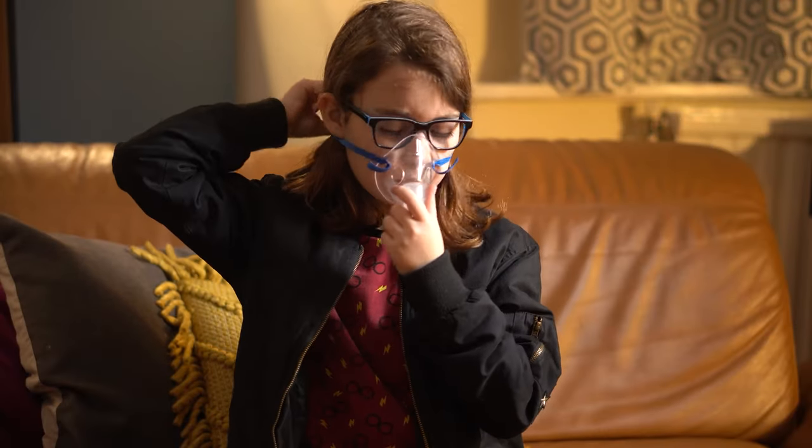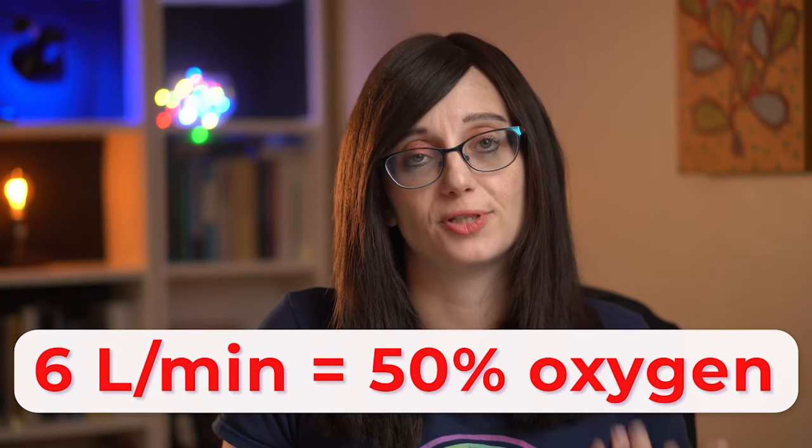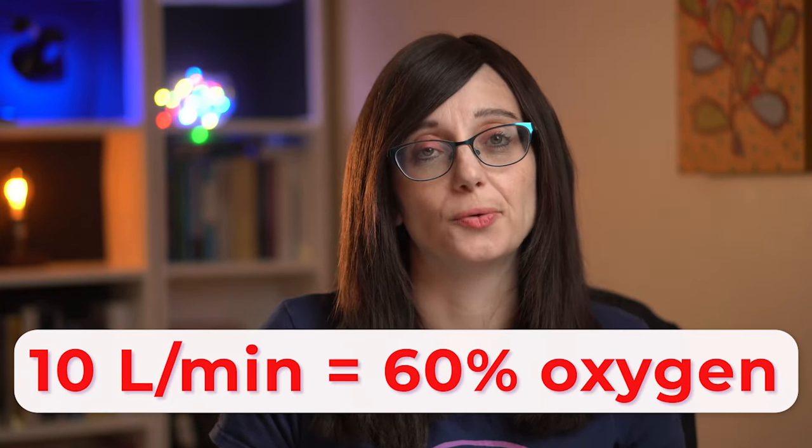A Hudson mask is another low flow option. This is a vented mask that fits over the mouth and nose, so you need to have a good seal. The airflow for a Hudson mask is controlled by the patient's inspiratory flow, so the oxygen delivery level is going to vary depending on the patient. As a rough guide, six litres per minute of flow is going to be around 50% oxygen, and 10 litres of flow is going to be around 60% oxygen.